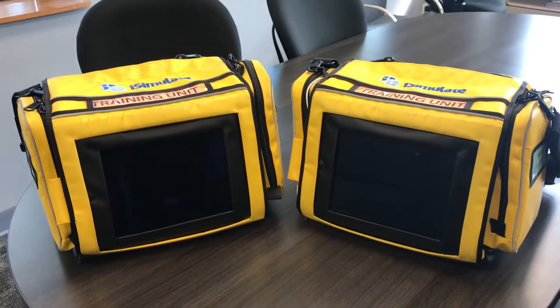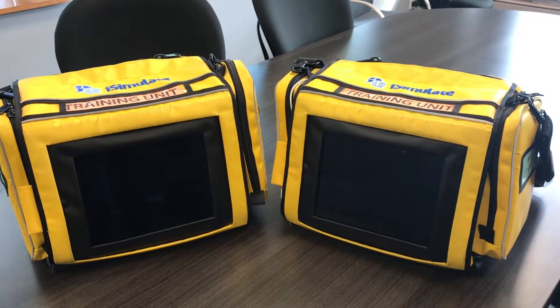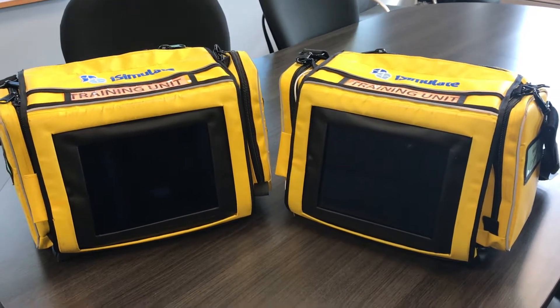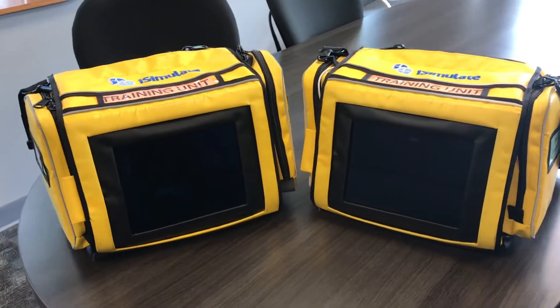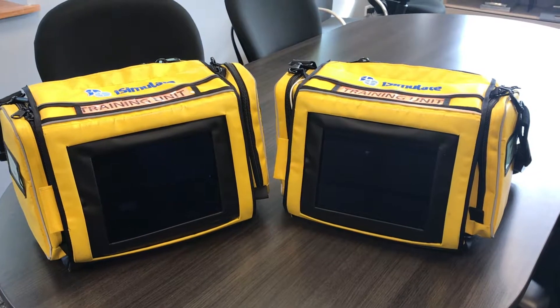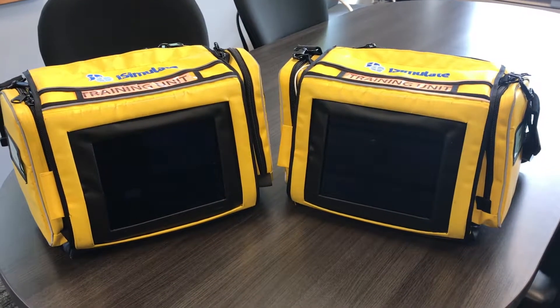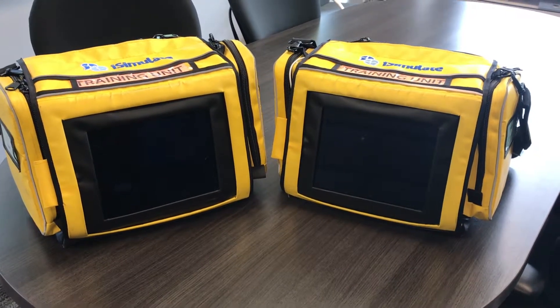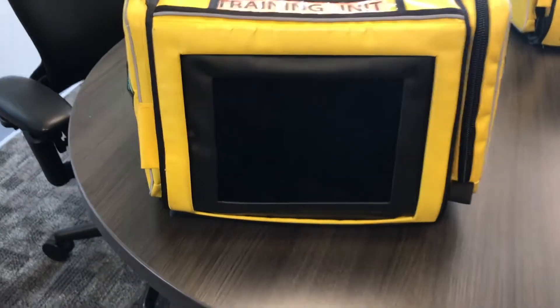Hey everybody, this is Billy Croft and I'm coming at you with this video to inform you of some new training props that we have in the EMS training division. As you can see, we have the iSimulate monitors here in front of you. We used to have their software but unfortunately the licenses ran out, so we had to go in a different direction and we have a new app that we use called SIMPL.